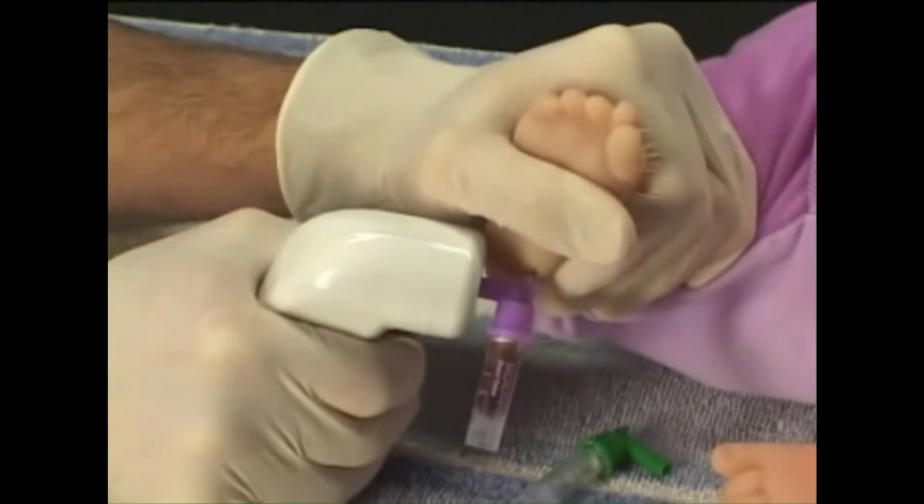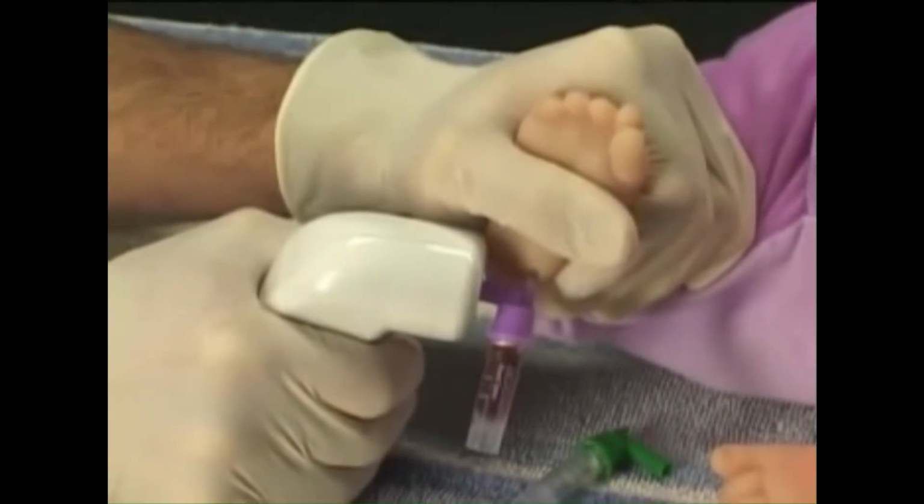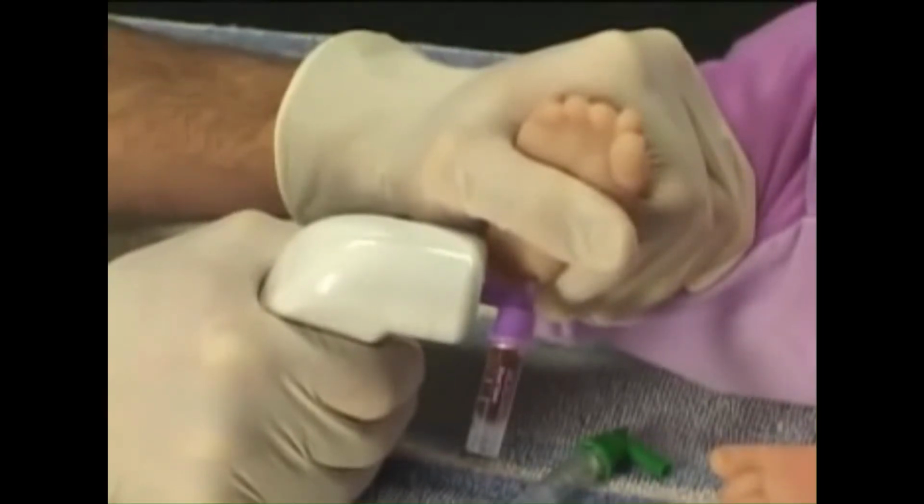Avoid scooping the sample from the puncture site. The vacuum action draws the sample into the collection vial. This eliminates the need to scoop, which causes hemolysis, and less squeezing is needed because the vacuum will collect even the smallest drops. You don't need a large hanging drop.